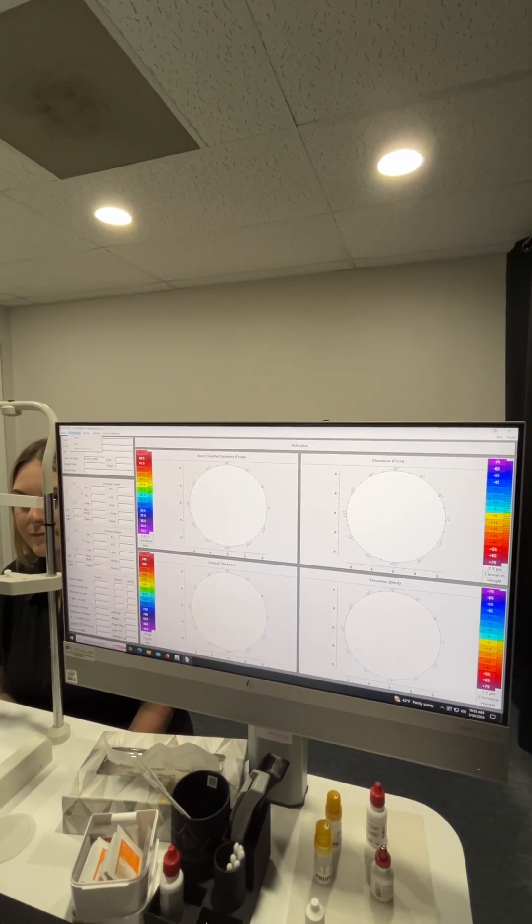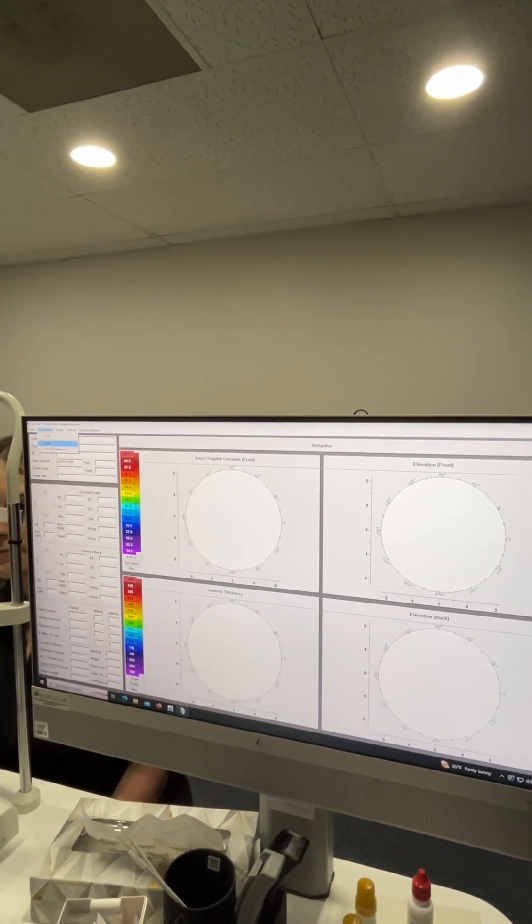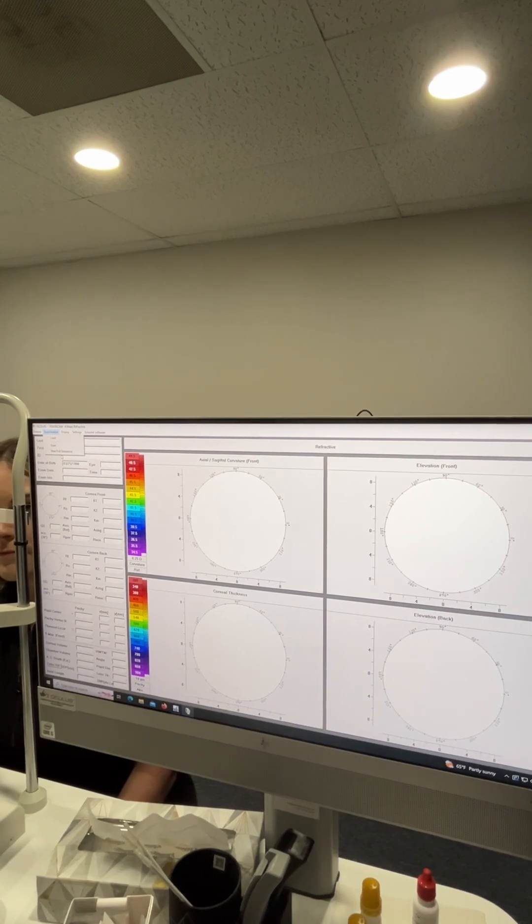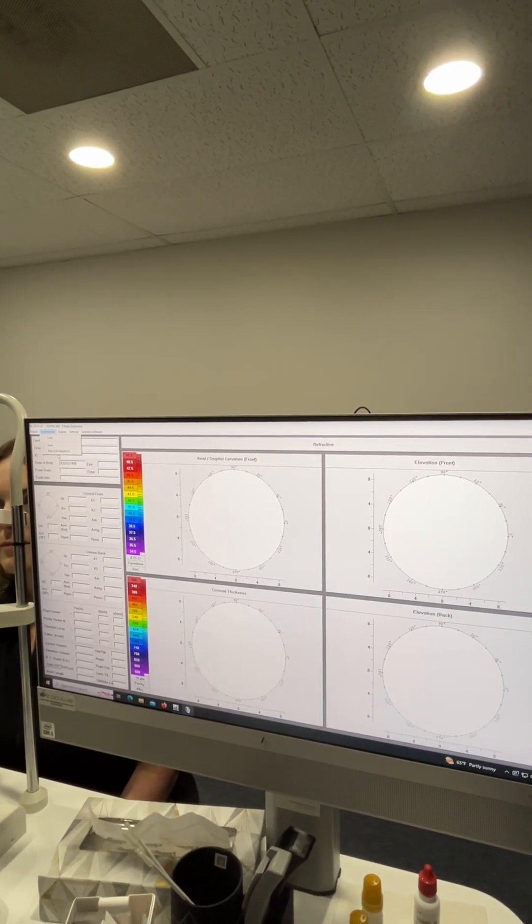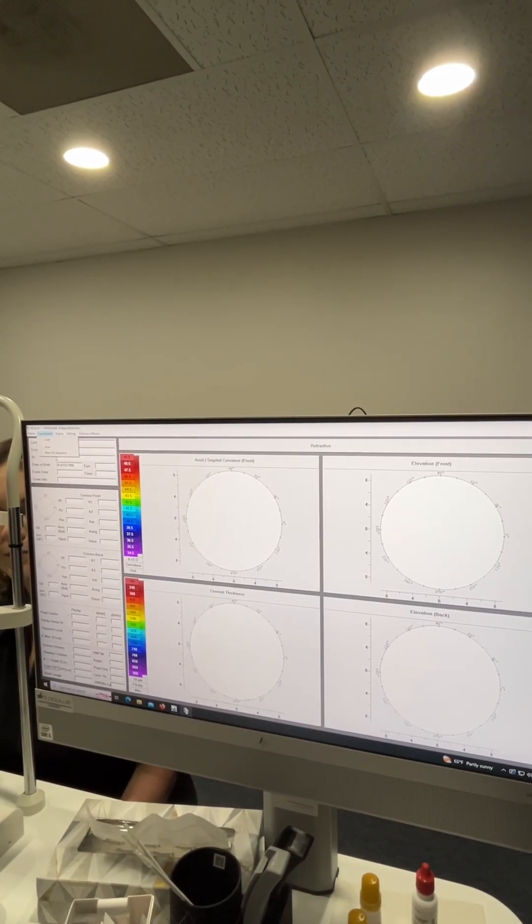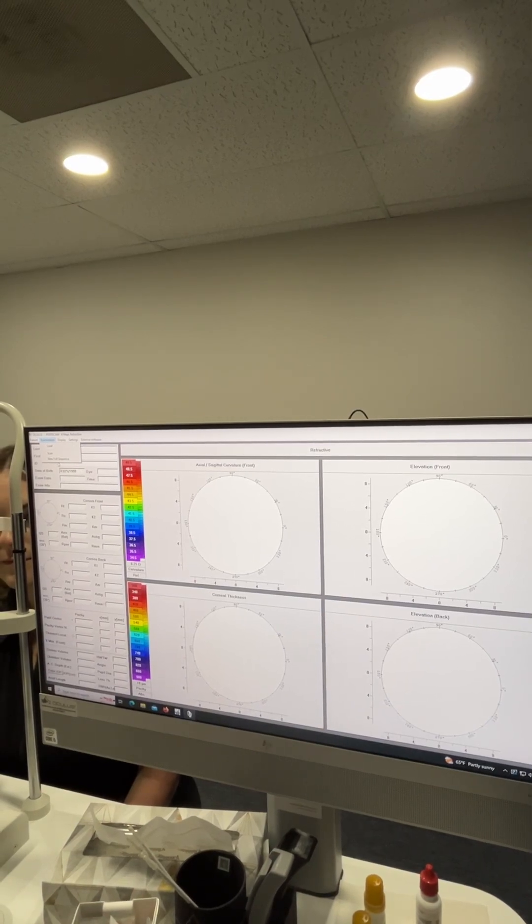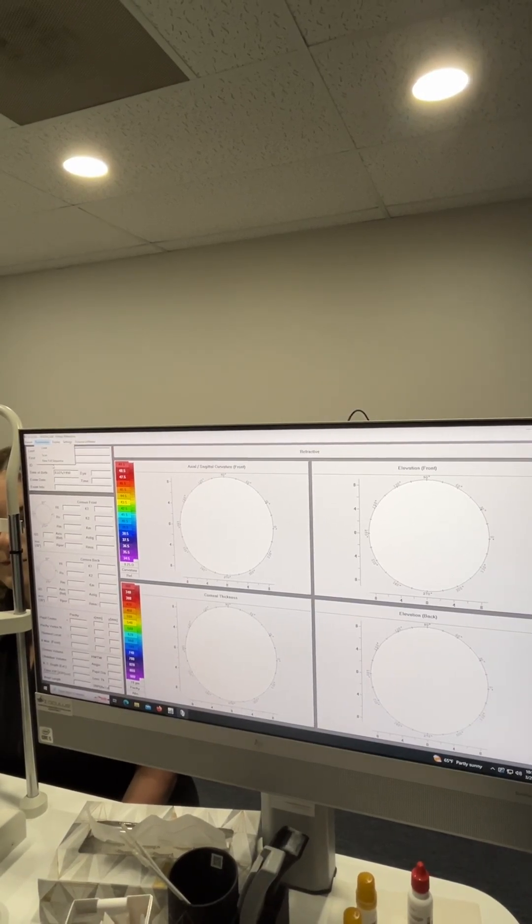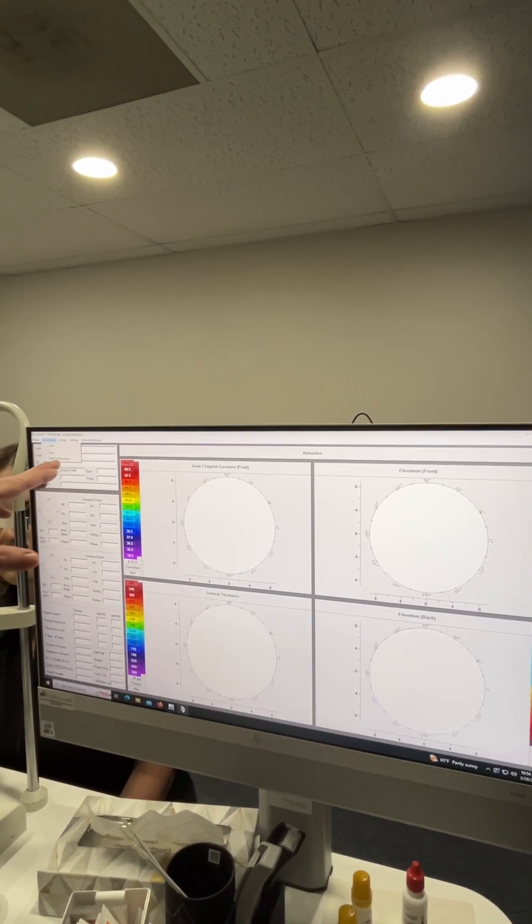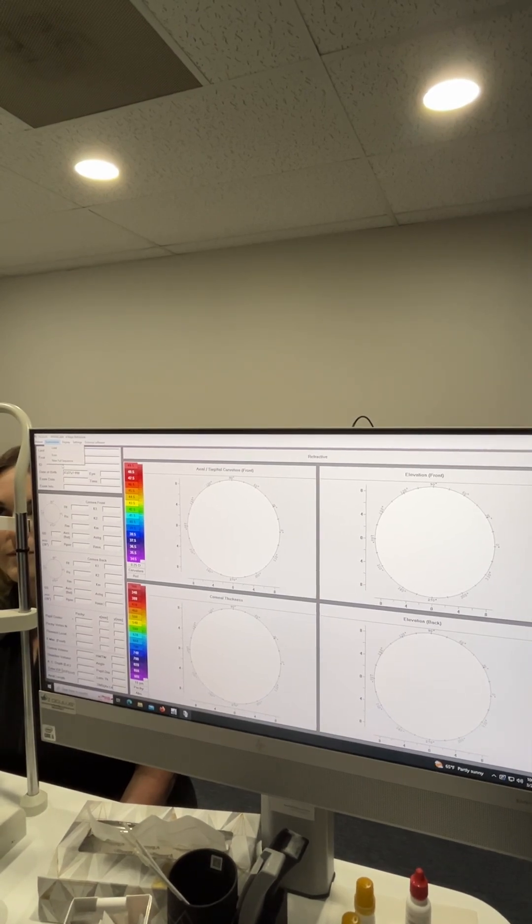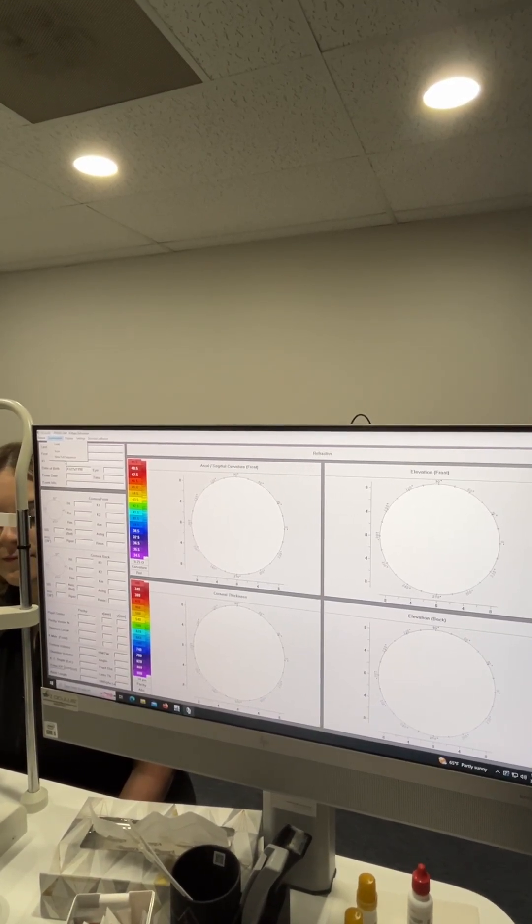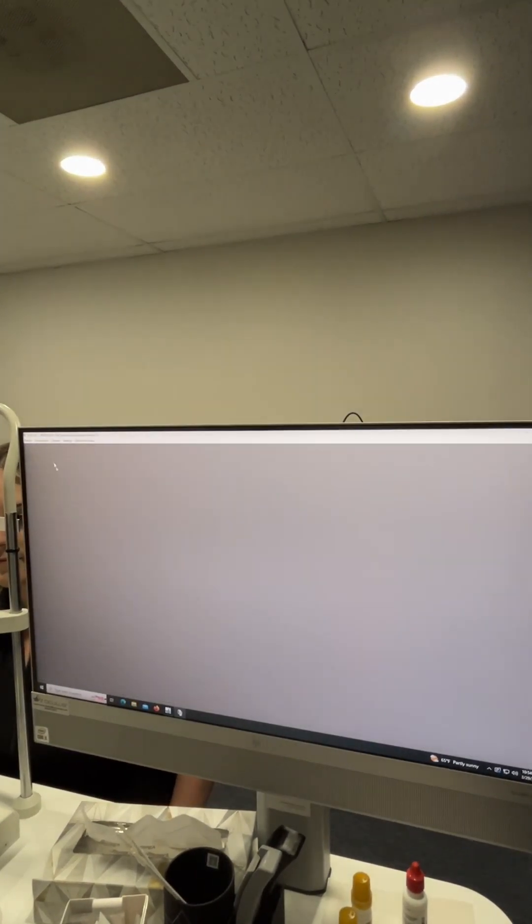You're basically going to go to examination and then you can do a scan, but because this is the Pentacam AXL wave, it's a multi-modality instrument so it's going to have a lot of different features. What we're going to use is a sequence. A sequence is going to walk us through each of those different modalities.